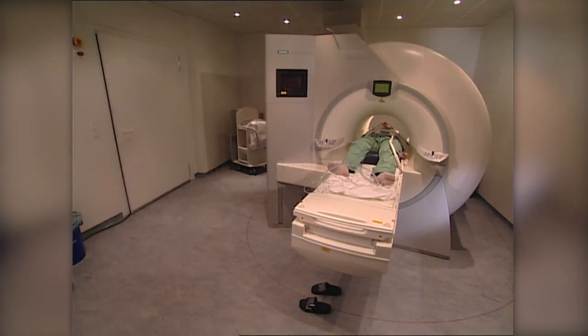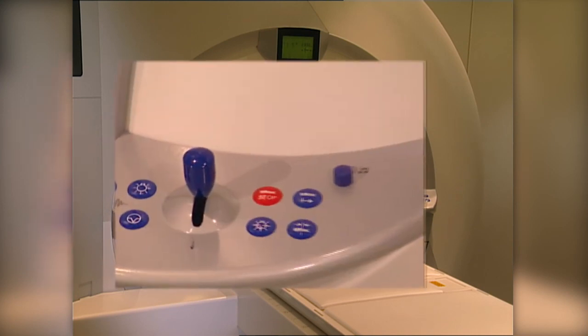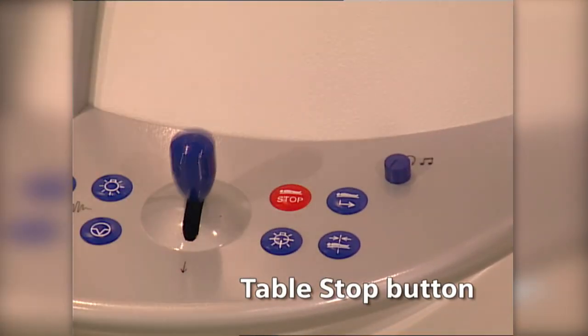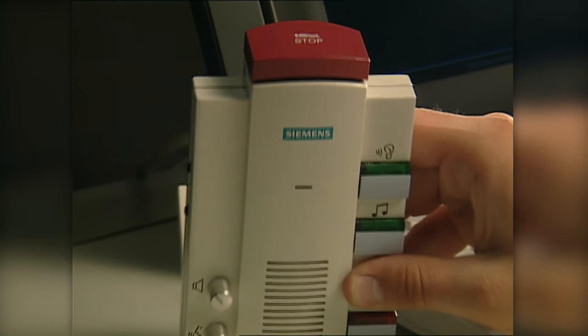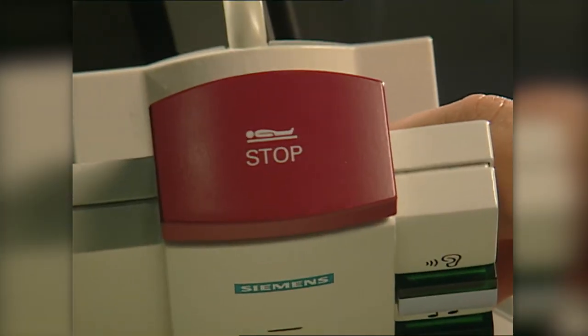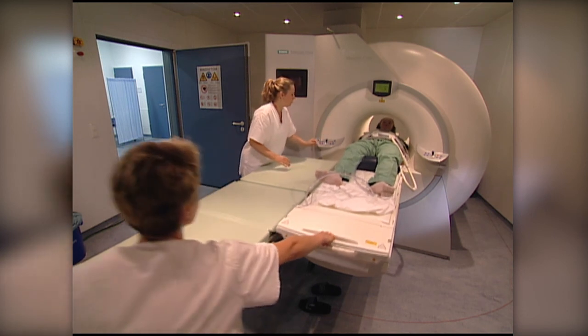If the patient is, for instance, caught between the gantry and the patient table, the table stop button must be pressed immediately. The stop button for the patient table is found on the right and left patient table control units and on the intercom. Pressing the button releases the brake so that the patient table can be moved manually.